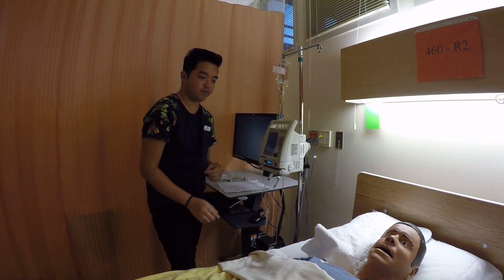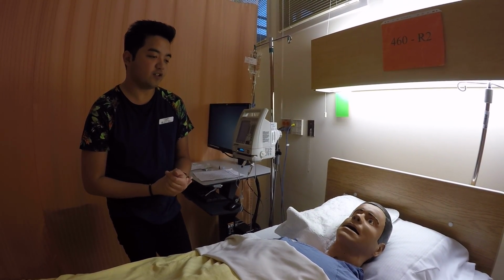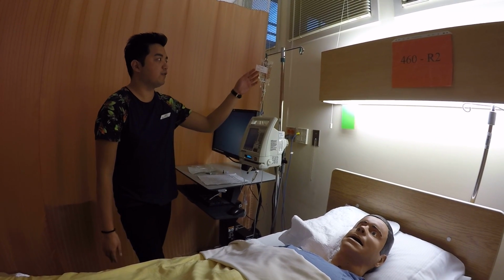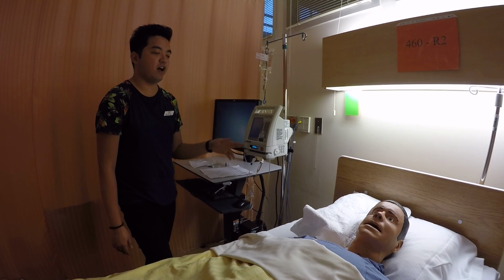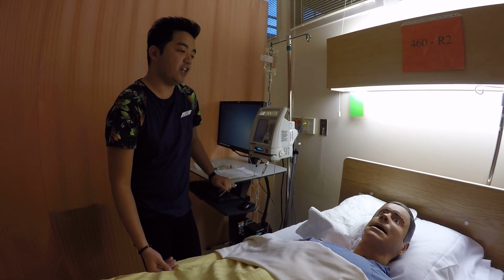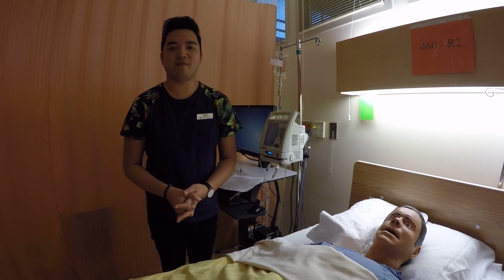And then also, Mrs. De La Cruz, I'm just gonna stay here for a while just to monitor you for any adverse reactions, okay? And then also, I'll visit you from time to time after that, and then I would be back approximately after an hour after the medication has been fully infused, just to make sure that it has been fully infused and that you don't have any allergic reactions or any adverse reaction. And also to further evaluate you for the effectiveness of the drug. Okay? And then yeah, that's how you reconstitute, dilute, and give an IV medication through a mini bag.